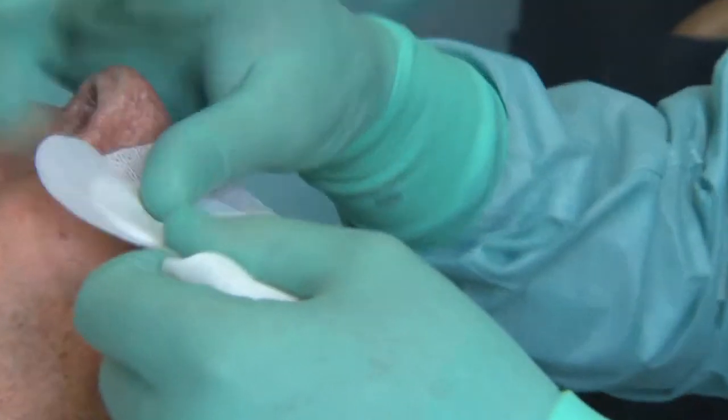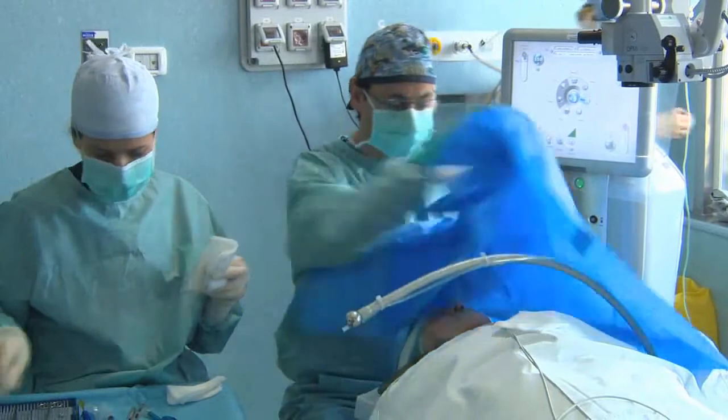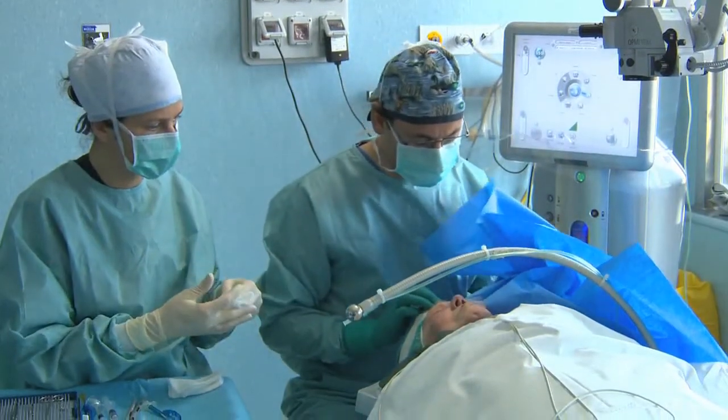To the extent that the biflex lens slides perfectly into the cartridge, and that the injector itself is a perfect fit for its conical shape, it goes without saying that with a 2.0mm incision the injector can easily enter the anterior chamber. Even with deep eyes, as can be the case with near-sighted people, you can insert the injector and, by extension, the lens into a very deep cavity, beyond the capsulorexis of the anterior capsule, in complete safety.